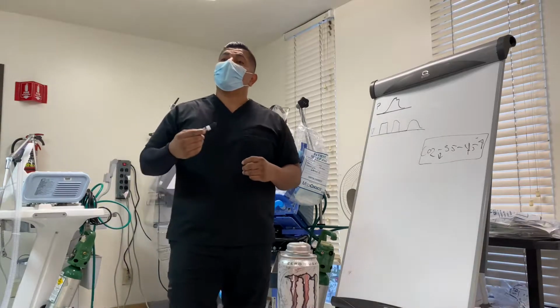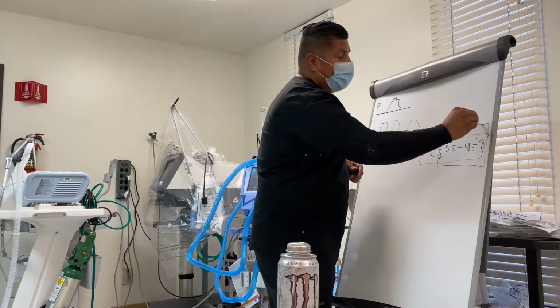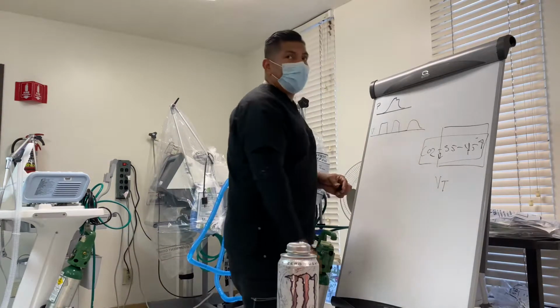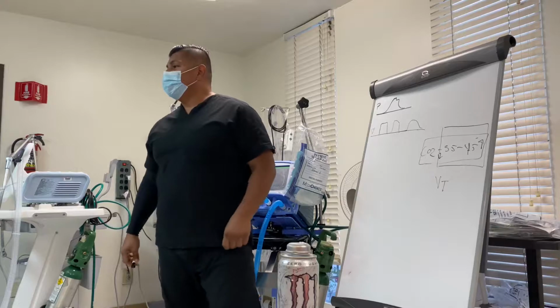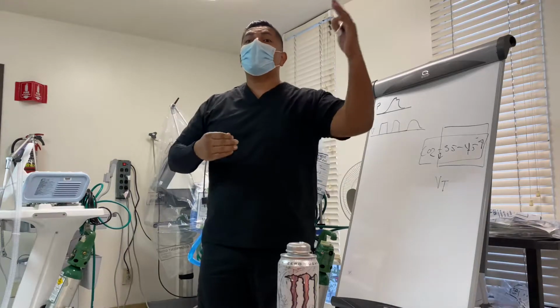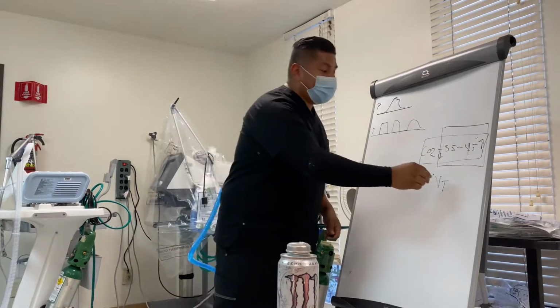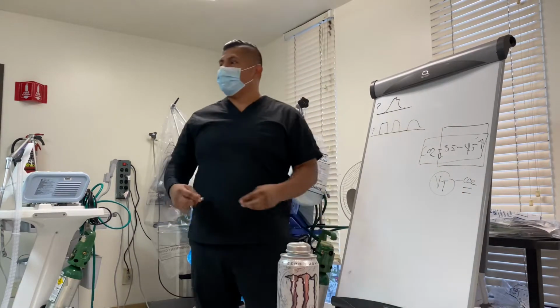If our entire reason for ventilating was to control CO2, the easiest way to control CO2 is by controlling the patient's tidal volume. And not only that, but guess what? I can calculate tidal volume. Remember, MDs make decisions, right? So their whole spiel is control. I control tidal volume, I control CO2. And if I can calculate the tidal volume, I can have even more control of my gas exchange.